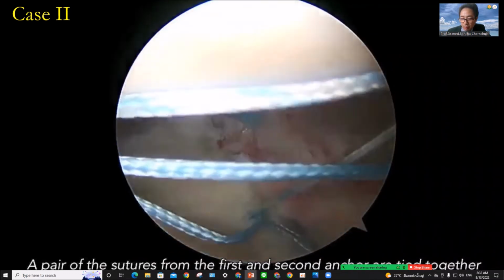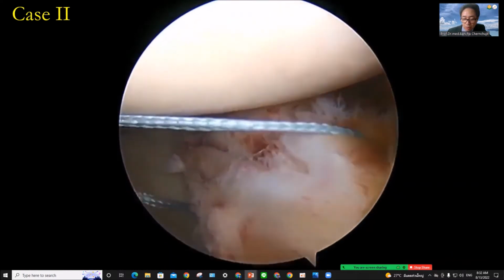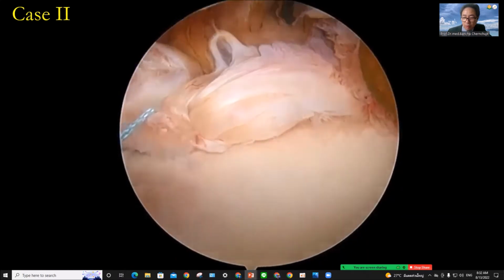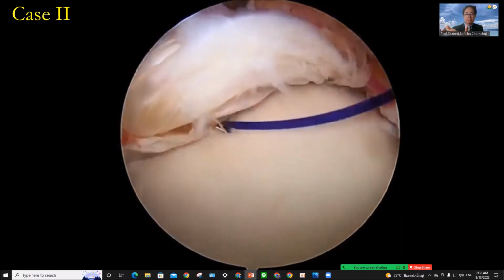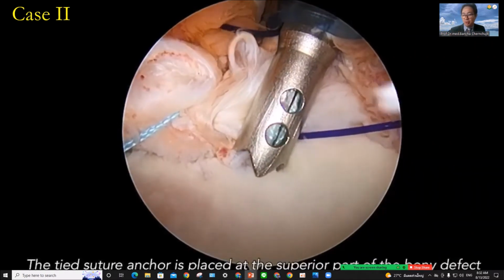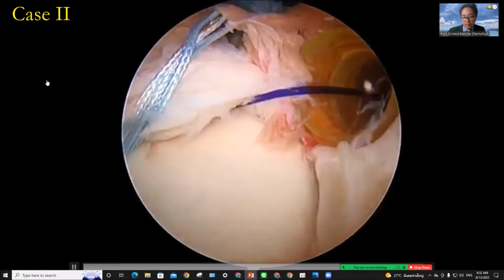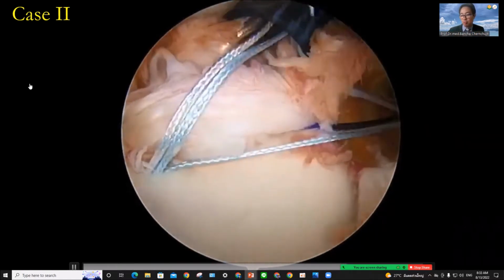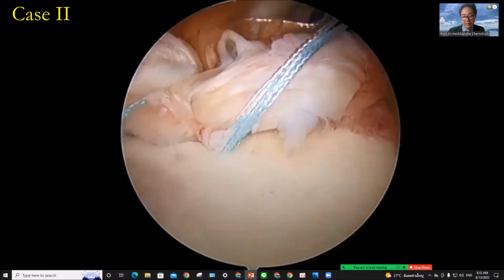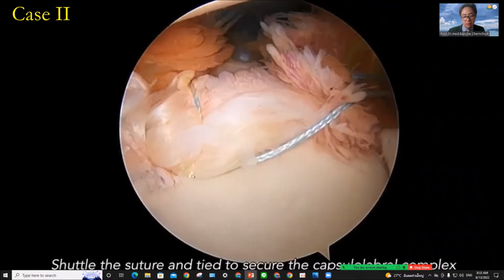After you mobilize the tissues, you do it the same way. I use the double load Suture Fix. Don't worry if sometimes your bone is tilting, I mean, when you tie the suture very tight. Don't worry, because when you release the traction, the head will mold this fragment and make it flat. So this is the third one. Tie the fragment.